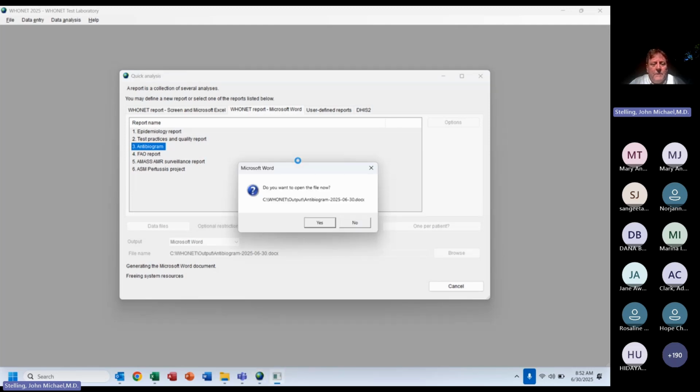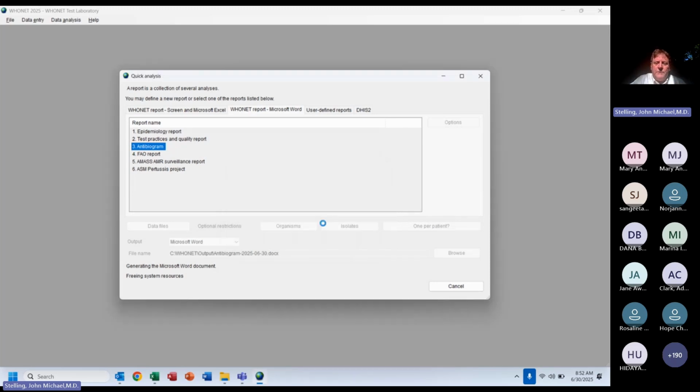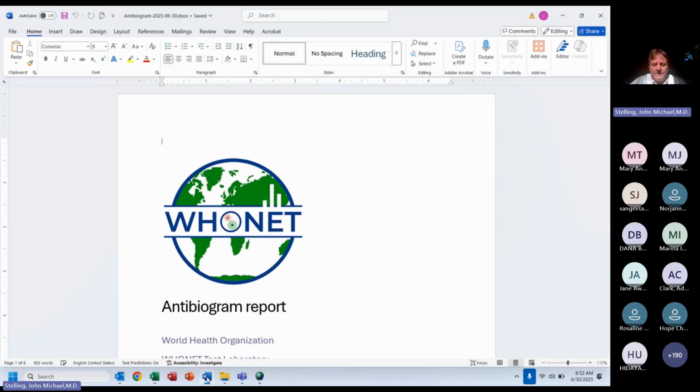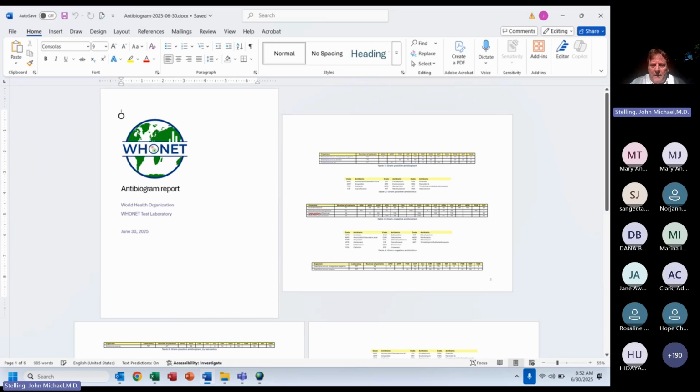Adam, can you, oh, okay, good, it's finished. But Adam, if you could start looking at the questions in the chat box. Okay, do you want to open the file now? Yes, I do. So one annoying thing is that the file is now open, but I don't see it. Where is it? I have to go down to the bottom and click on the Word icon, and there it is. So this is the antibiogram report.